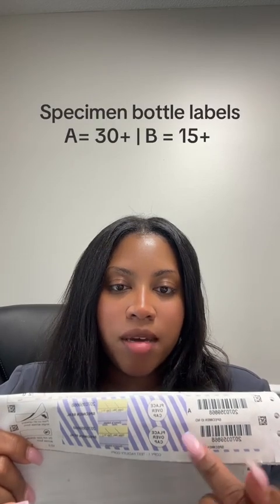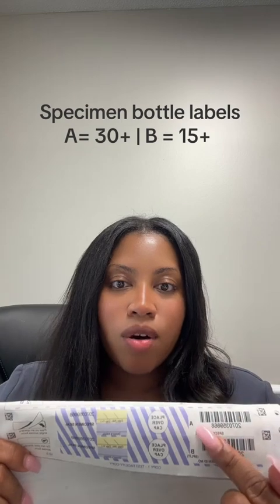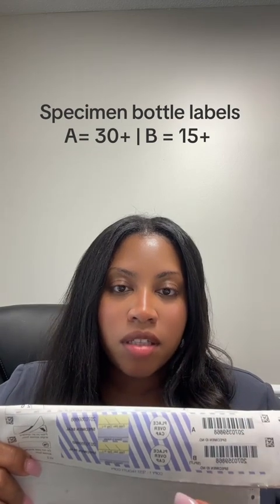On your CCF, which is your custody control form that you've been completing this whole time, there are going to be these 2 specimen labels, A and B. A is going to go on the bottle that has 30 milliliters of urine.